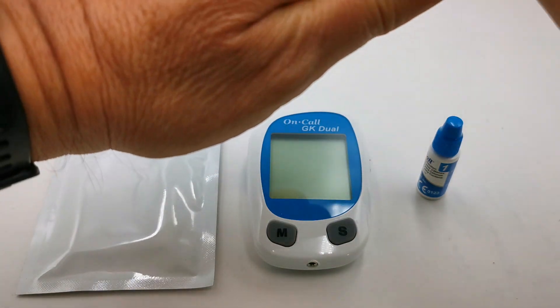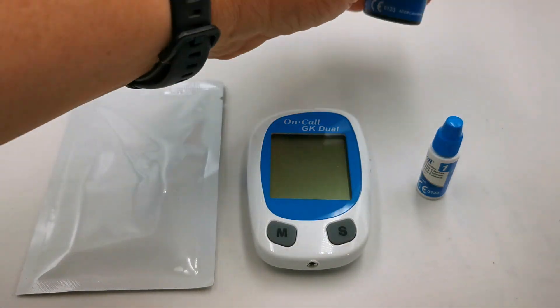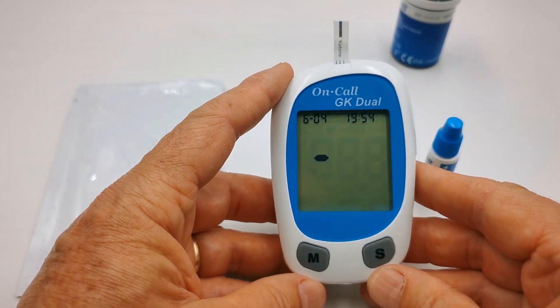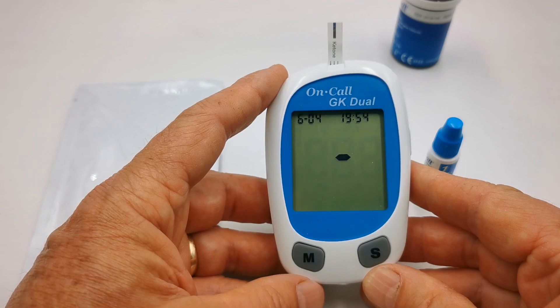This meter is ready and set up. When you're ready to perform the test, take a test strip out of the vial and place it into the meter. It will take a second or two to recognize the strip.